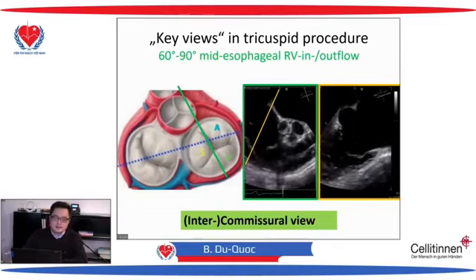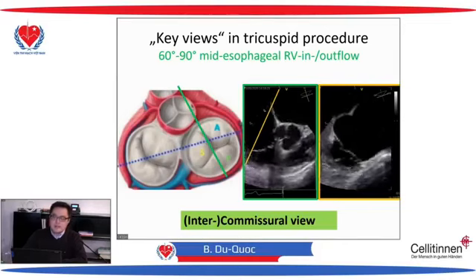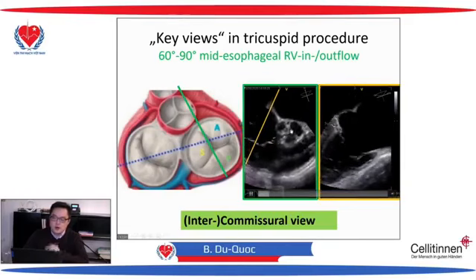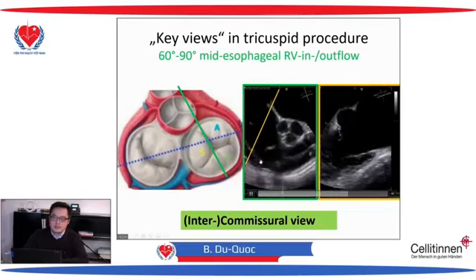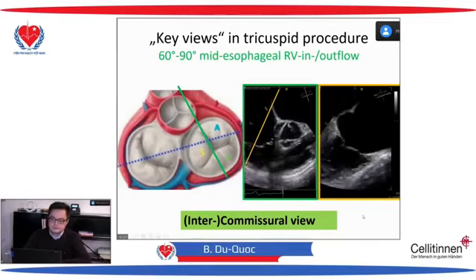To understand the tricuspid valve, you have to know some anatomic landmarks I want to share with you, because this short view, you know, if you do aortic assessment, but the tricuspid valve is very difficult, so I want to go to the landmarks.